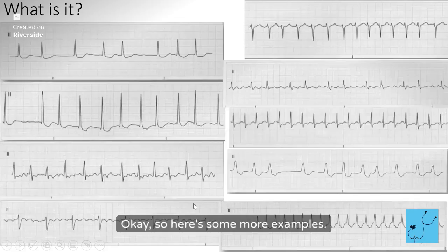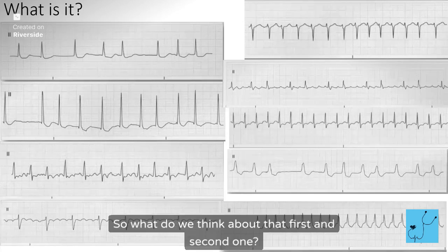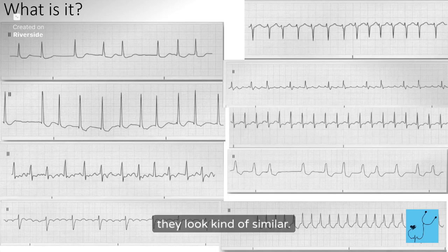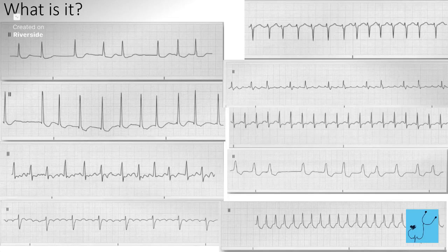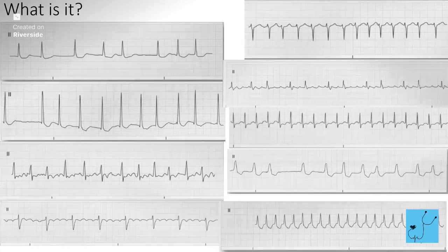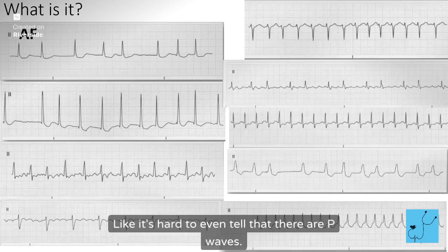Okay, so here's some more examples. So what do we think about that first and second one? Because they look kind of similar. They're both AFib. How is the second one different? Yeah, it's a little faster, right? And these examples are good because they don't really show a lot of P waves. It's hard to even tell that there are P waves.